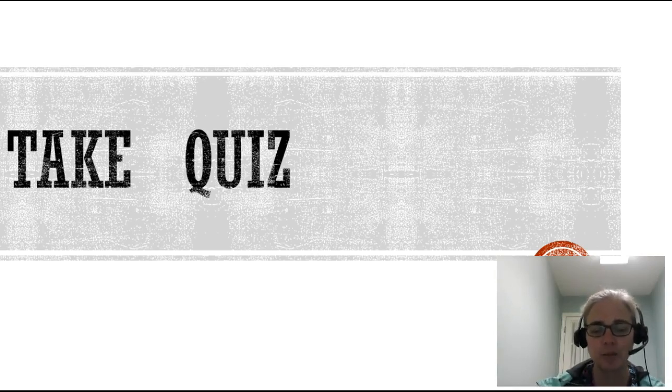Number 8, each new box of pregnancy kits will have a lot number and an expiration date. And this is true, and this is something we need to record. And also remember, when we open a new box, that we will need to run controls in it. Hopefully I will be the one taking care of that, but if you happen to open it up and you don't know what to do, please come find me and I will take care of that for you.